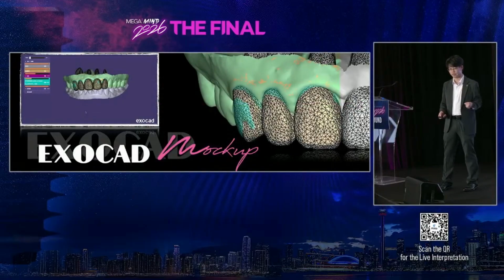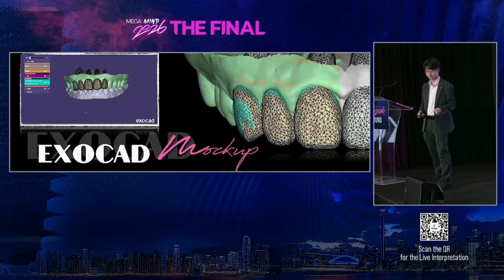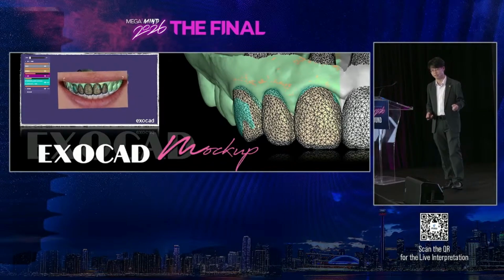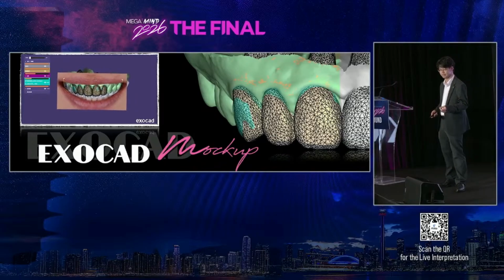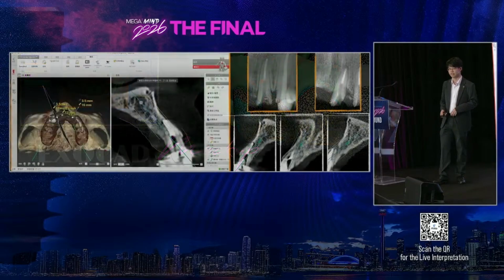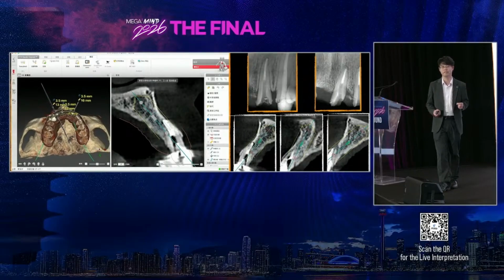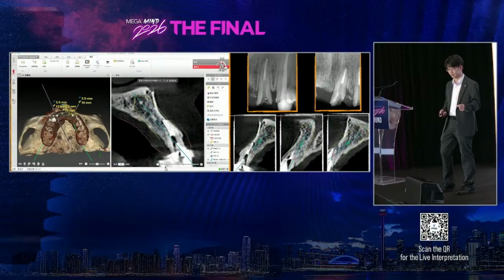First, we use ExoCAD to design the mock-up based on the profile and smile line. And also with the DTX software to design the implant positions for the patient.